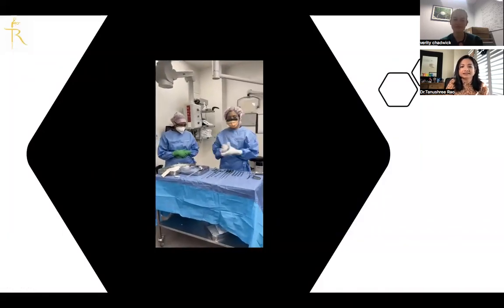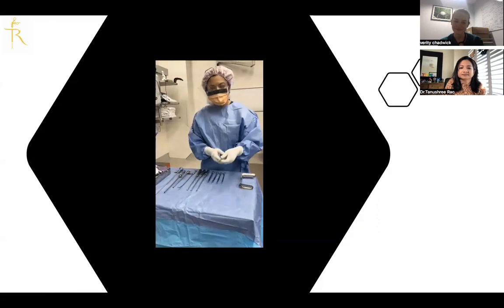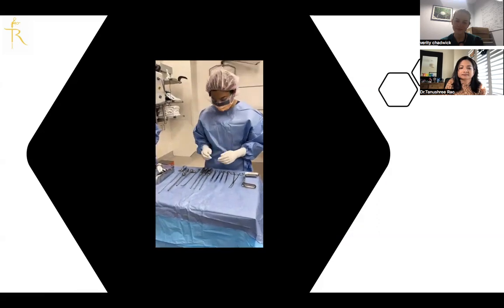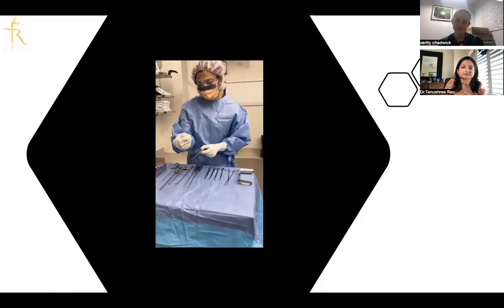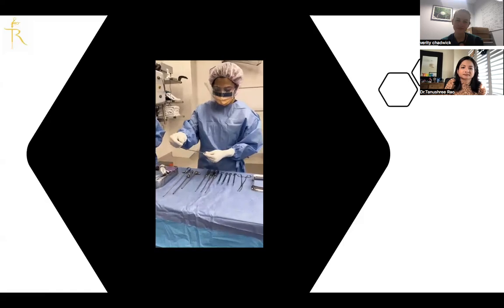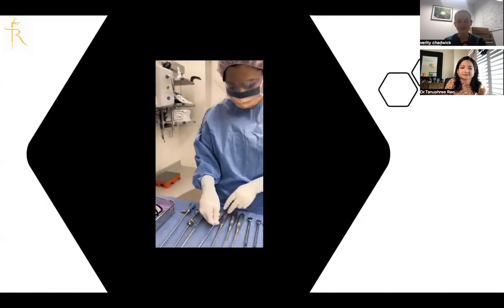I'm Colin. We're here to demonstrate the basics of hysteroscopy. So we're just going to quickly show you all the instruments in the hysteroscopy tray, which is a must, starting with a Sims speculum. We have a vulsellum to grasp the cervix. We have a wide range of Hegar's dilators, starting from size 4 over here, which is used to dilate the cervix in case you have a bit of difficulty. Following which, these are called uterine curettes. They have a bit of a sharp edge to it, and they take endometrial biopsy, or they're used in D&Cs. Different sizes, small, medium, and then we have the large. This is called the uterine sound, where we actually measure the size of the uterus. If you come a bit closer, you will be able to see the graduations over here. So it starts from 4, 5, 6, 7, gives us the total uterine cervical length.